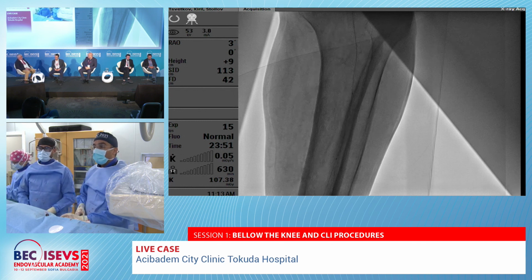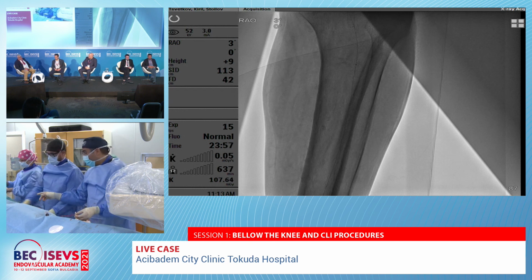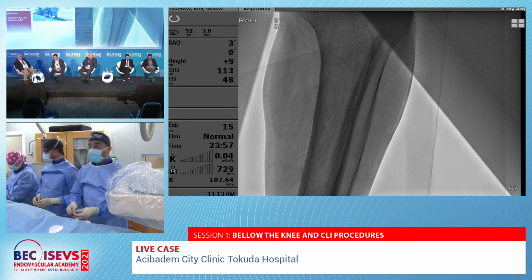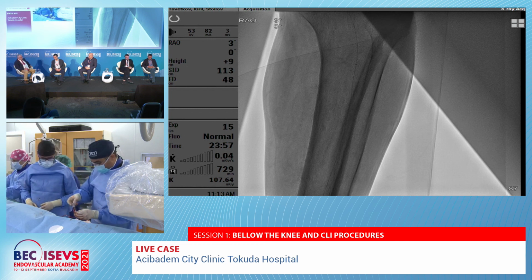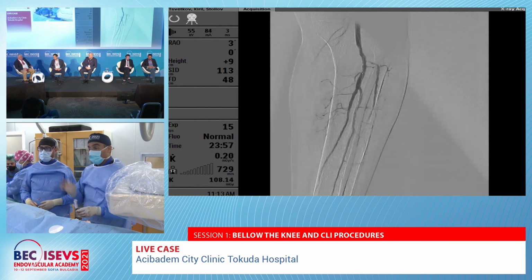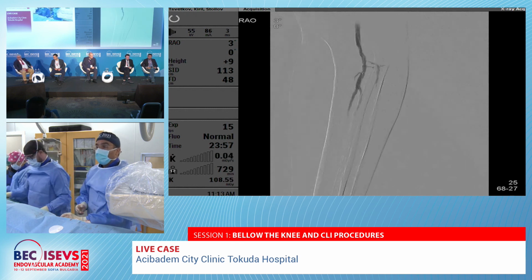Dr. Nikolov? Well, the procedure is too long now, and I think 2 is good enough. I would rather give it a try for the anterior because the patient has an unhealing wound in the distribution of the anterior tibial artery. And I believe it's doable. We'll get the Bernstein. Okay, good.